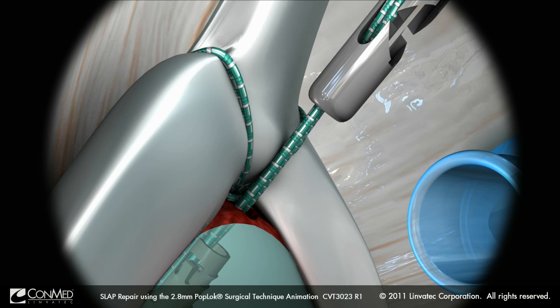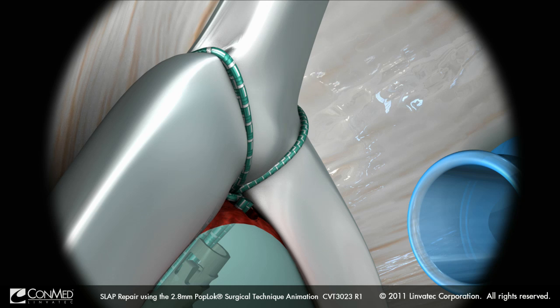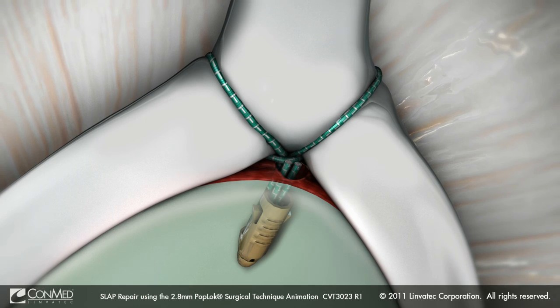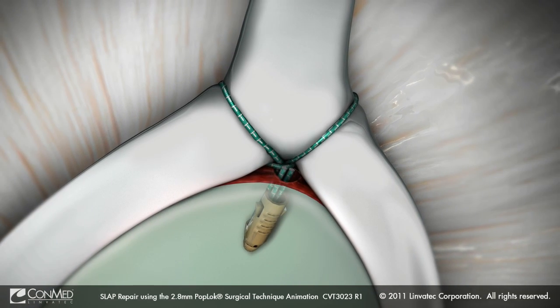The tails of the remaining sutures are then cut with the Katana suture cutter. This repair has the advantage of securing the biceps tendon with a low-profile anterior-posterior safety belt loop that simultaneously ensures dynamic eversion of the labrum.